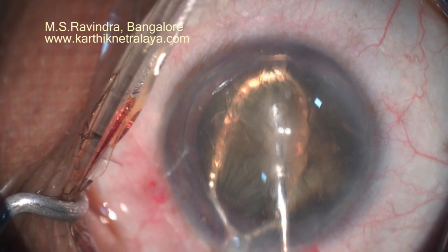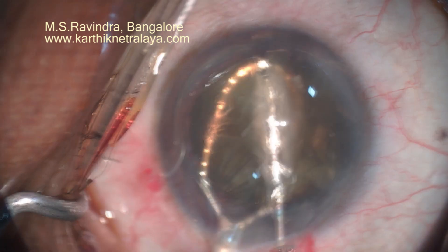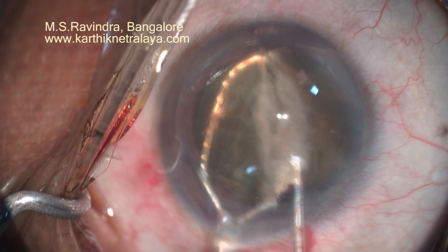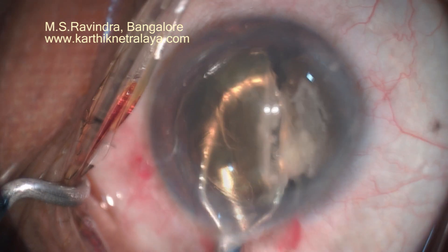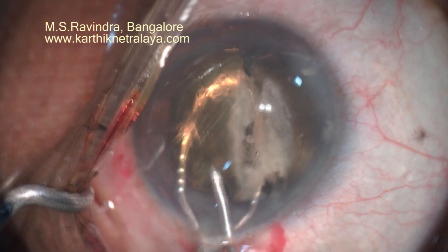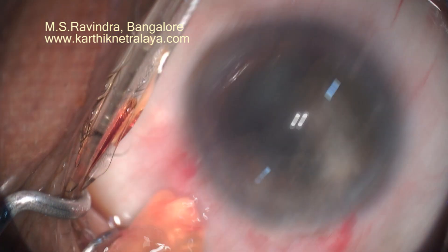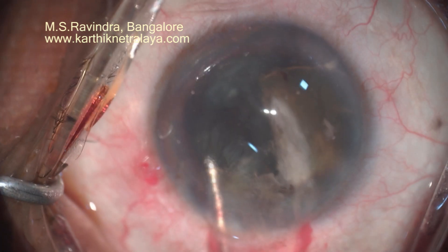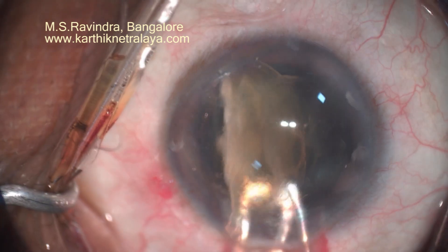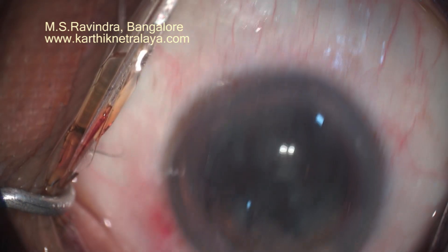The nucleus-epinucleus mass is rotated within the capsular bag, rotated into the anterior chamber, and then bisected with the shaft of a 25-gauge cannula which is continuously injecting visco in front of the nucleus so that it doesn't drop onto the endothelium. Without stretching the opening made in the limbus and cornea, the nucleus — which is half-divided — is removed.